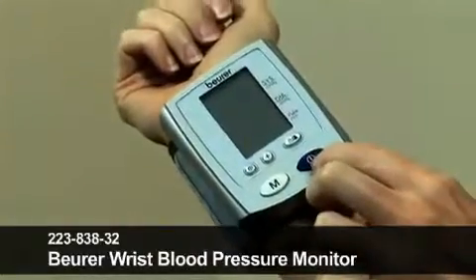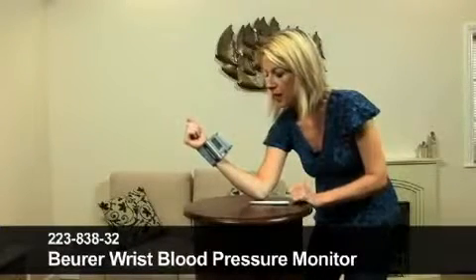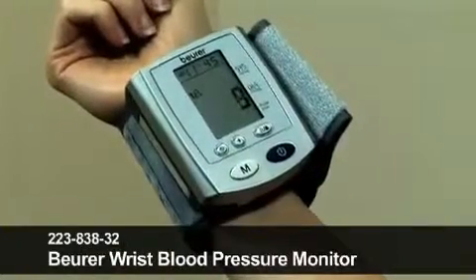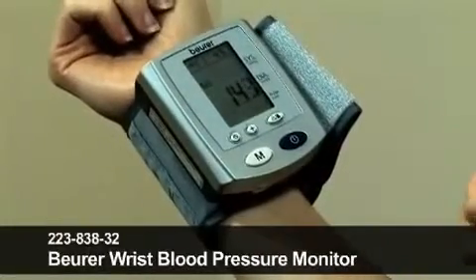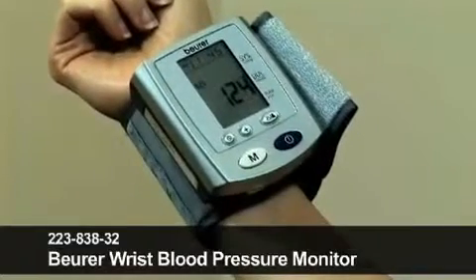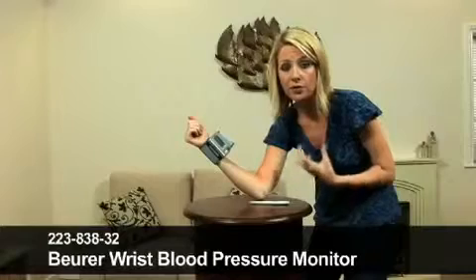I'm going to press the blue button here to switch it on, and all the figures come up there on the display screen. If you've ever had your blood pressure taken in a hospital, you'll be familiar with this — the cuff is going to swell up and it's counting down, monitoring my blood pressure and my pulse as well.